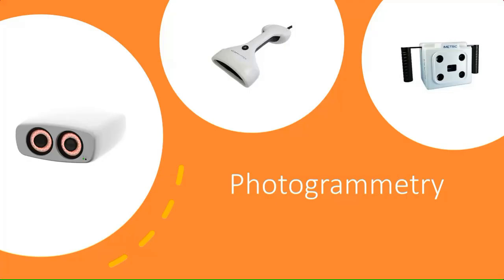So I want to start off a little bit on photogrammetry from a high level. Right now, there's three systems in the market, and we anticipate next year at least 3 to 4 new ones to come out. And as Jeff said, we thoroughly test everything. So we've tested accuracy of these, and we can confidently say that we accept all photogrammetry inputs right now to produce the NobelProcera prosthetics. So whether it's from a PIC camera, a micron mapper, or an iMetric.